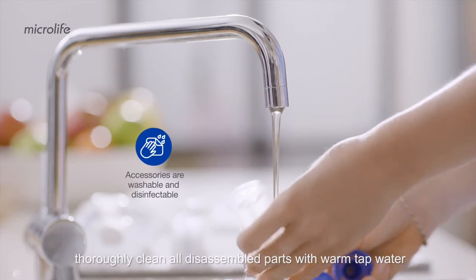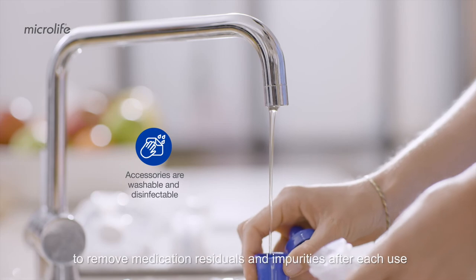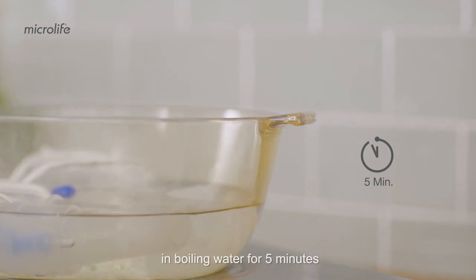Thoroughly clean all disassembled parts with warm tap water to remove medication residuals and impurities after each use. Disinfect the nebulizer, mouthpiece, and mask in boiling water for five minutes.